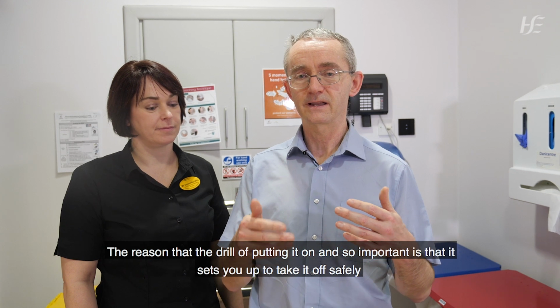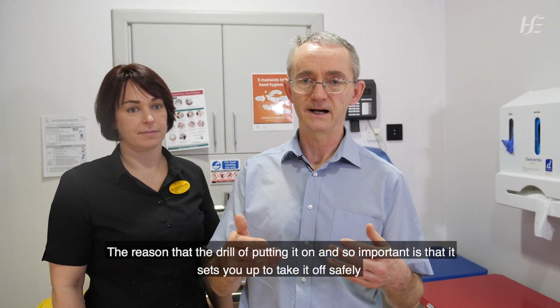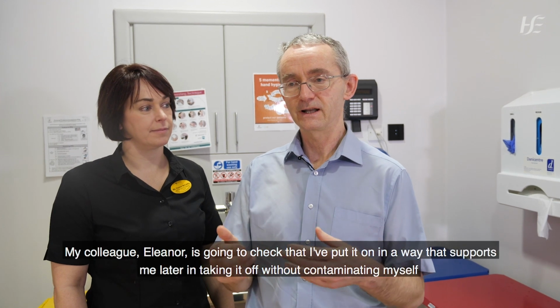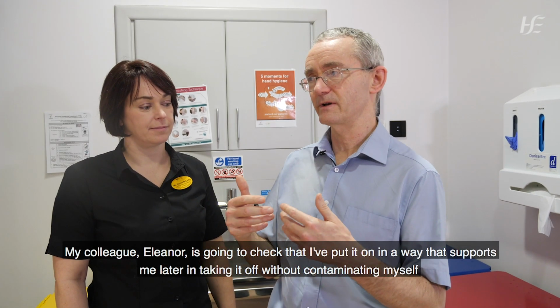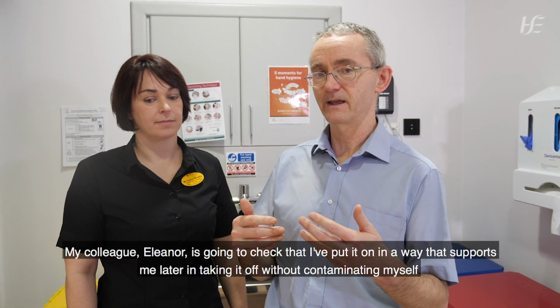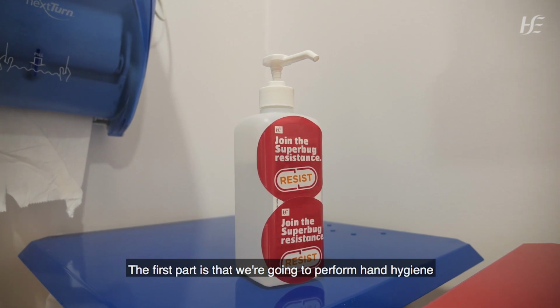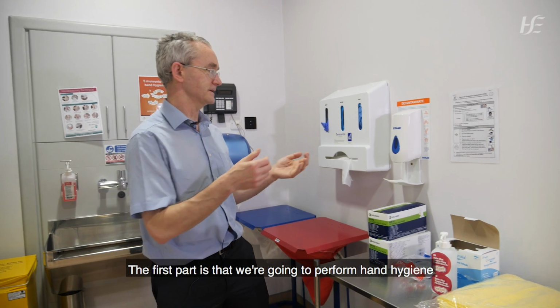The reason that the drill of putting it on is so important is that it sets you up to take it off safely. So my colleague Eleanor is going to check that I've put it on in a way that supports me later in taking it off without contaminating myself. So the first part is that we're going to perform hand hygiene.